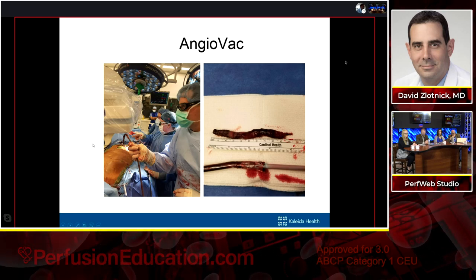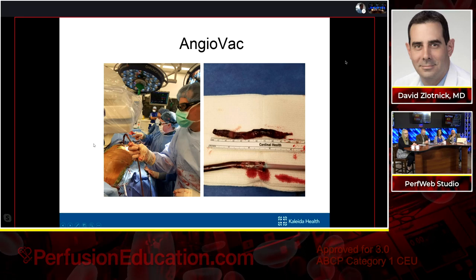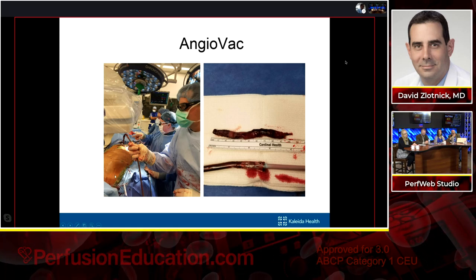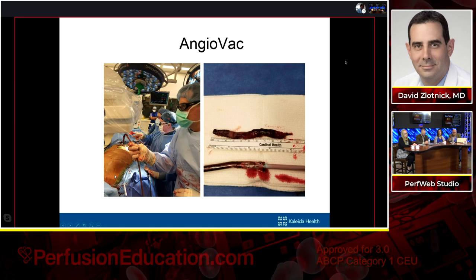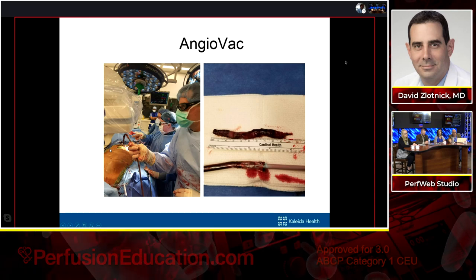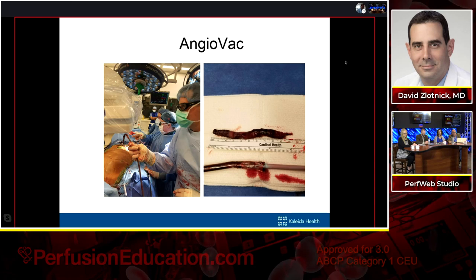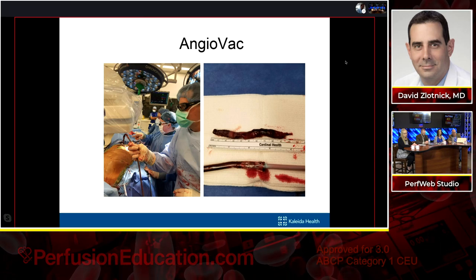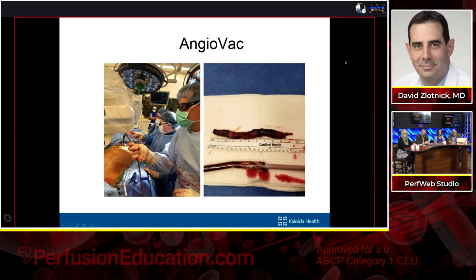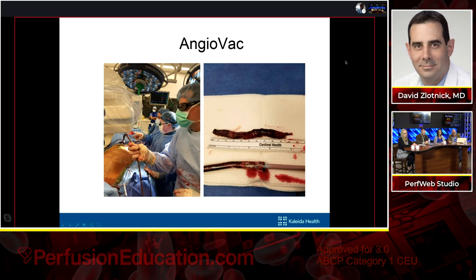So what you don't see is over here on this other side of the table is the surgeon that I work with, as well as my echocardiographer doing surface echo. And when we got in there, we went from an IJ approach. As soon as we went on flows, we lost flow. And so we waited for 2 minutes, let the clot kind of work its way into the cannula. And after 2 minutes, I just started to gently advance my cannula and retract it. And we could see that the clot was moving just on transthoracic with the cannula. So we knew that the clot had worked its way into the cannula, and I brought it out through the Gore DrySeal sheath, and you can see about a third of the clot was in the cannula with two-thirds still out, and everything kind of came out.